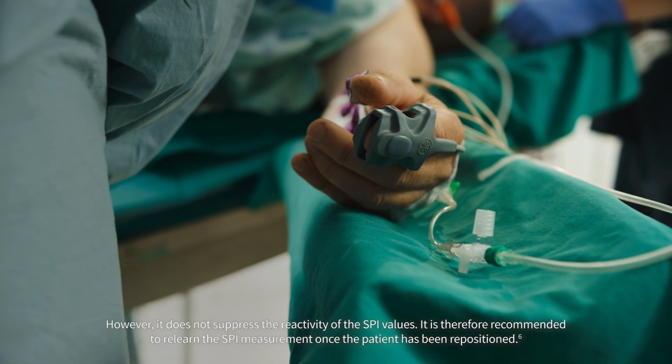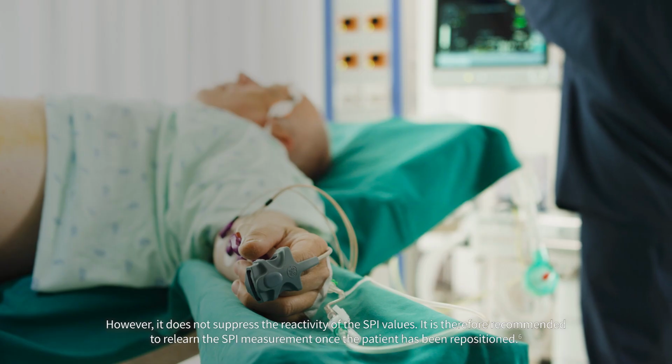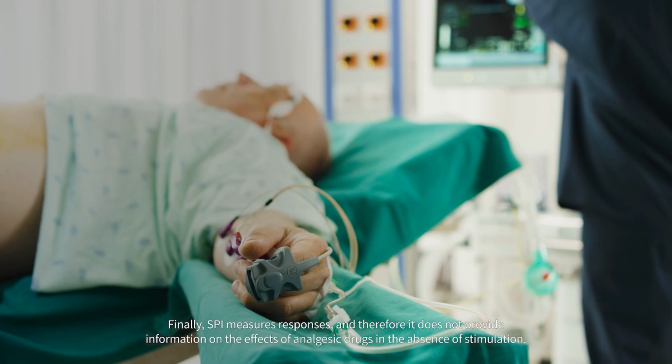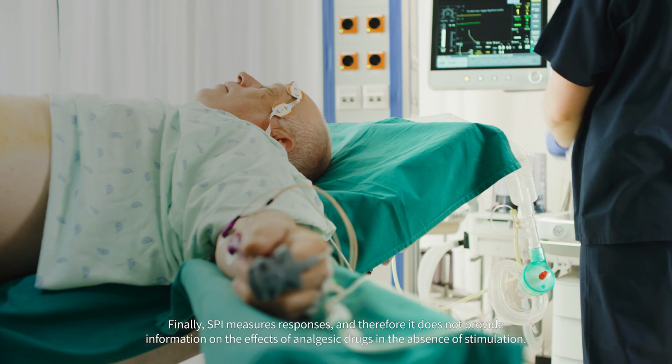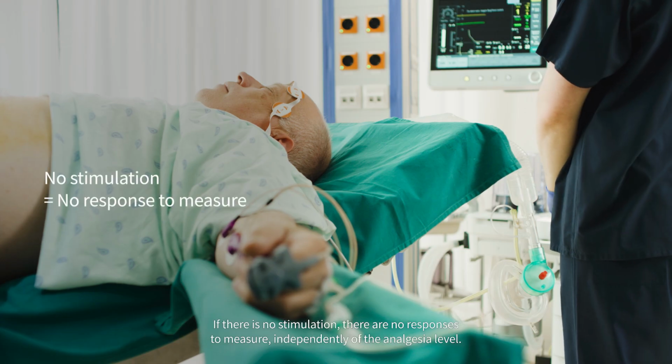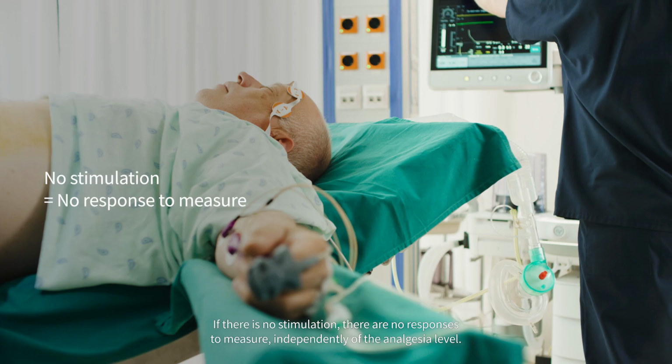It is therefore recommended to relearn the SPI measurement once the patient has been repositioned. Finally, SPI measures responses, and therefore it does not provide information on the effects of analgesic drugs in the absence of stimulation. If there is no stimulation, there are no responses to measure, independently of the analgesia level.